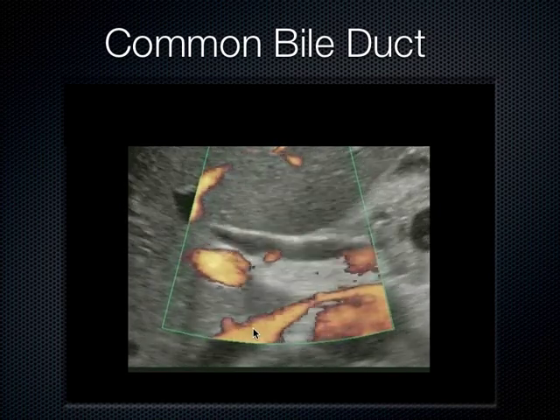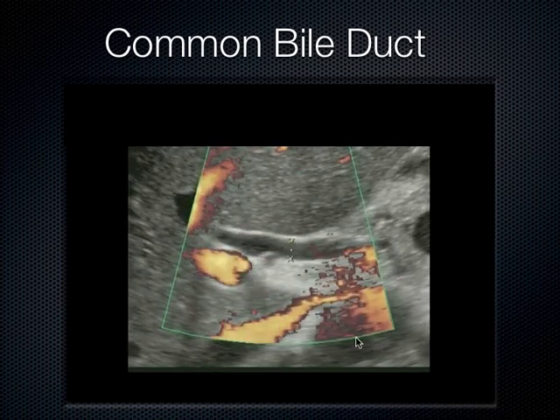So this is the aorta actually right here, IVC. This is left renal vein coming over and dumping into IVC, just right on top of the aorta. But what I want you to focus on right now is the portal vein, which is over here, anterior to it, that does not have any flow in it. Here is the common bile duct. This was hepatic artery right there.